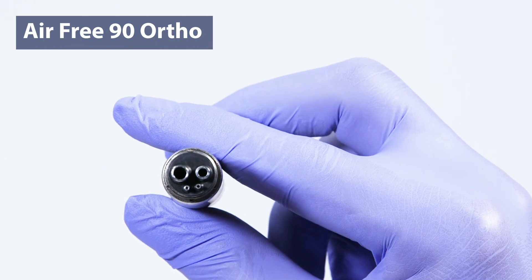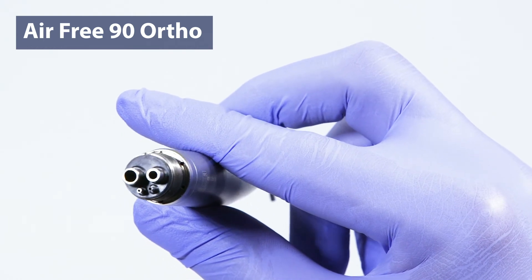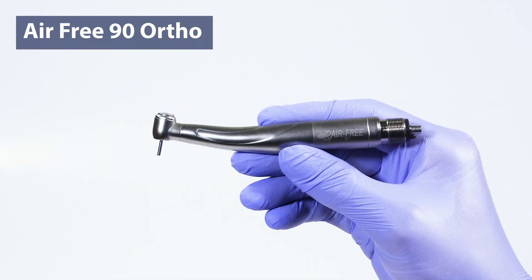It's time to say bye-bye cold air, hello comfort with the orthodontist's best friend.